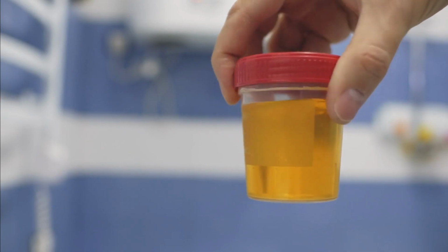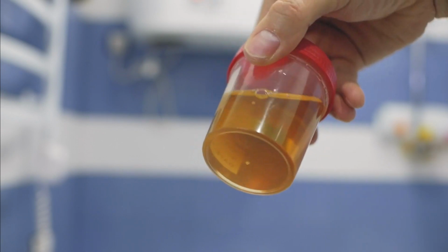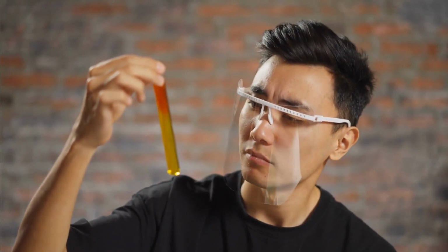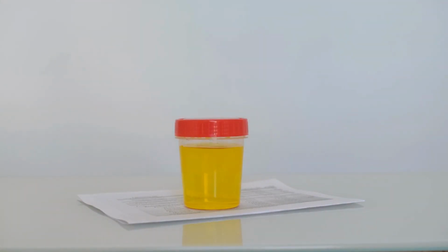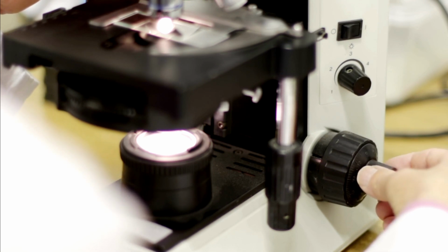First, we'll focus on the color and appearance of urine. Different colors and appearances provide valuable insights into your bladder and kidney health. For instance, if urine is red, it might indicate hematuria: hema, referring to blood, and uria, meaning presence in urine. However, the usual color of urine should be yellow, slightly yellow, or clear. Also, the appearance of urine should be clear to slightly cloudy. However, cloudy urine should be examined further using a microscope. The clinical laboratory scientist will view the urine under the microscope to see what is making the urine cloudy.